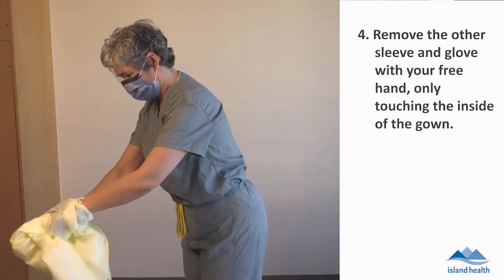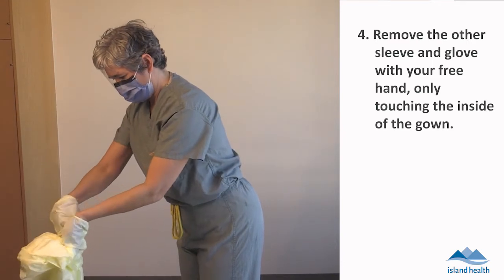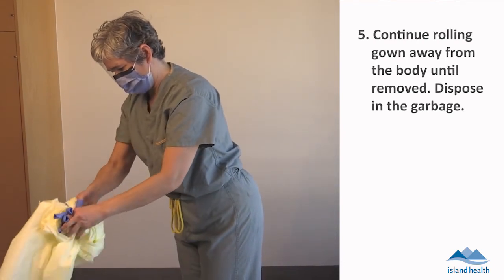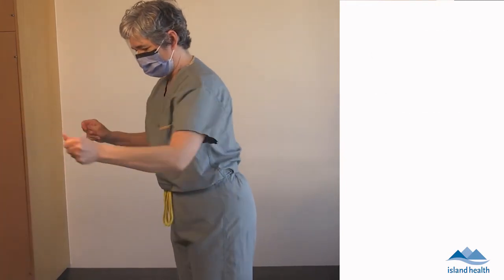Remove the other sleeve and glove with your free hand, only touching the inside of the gown. Continue rolling the gown away from the body until removed. Dispose in the garbage.